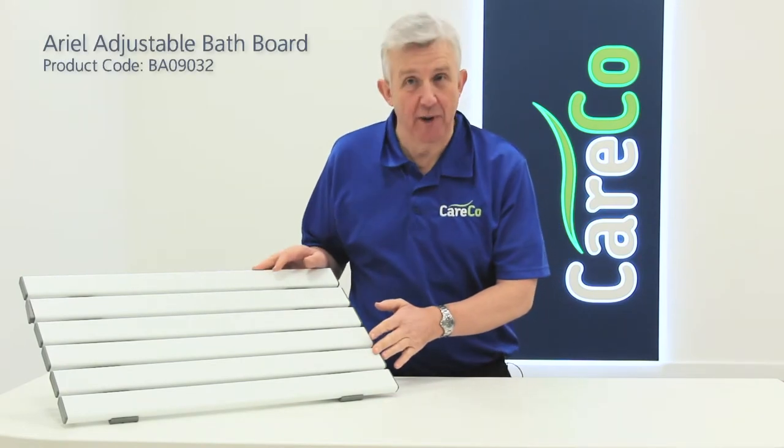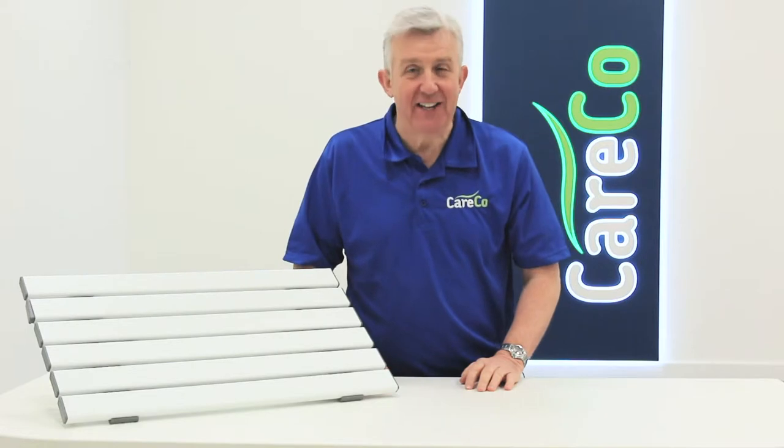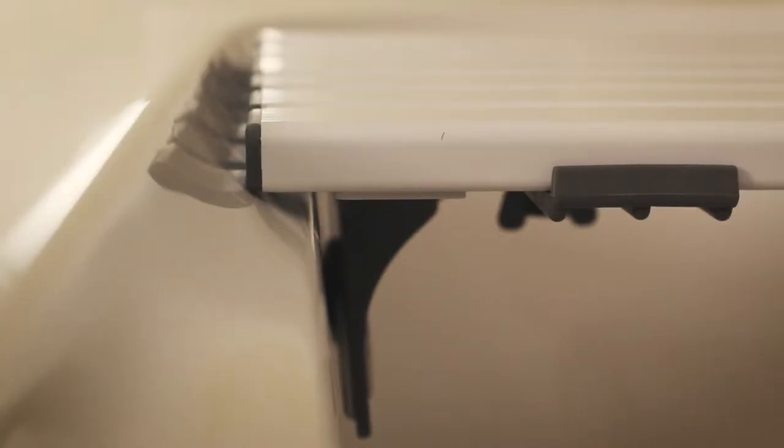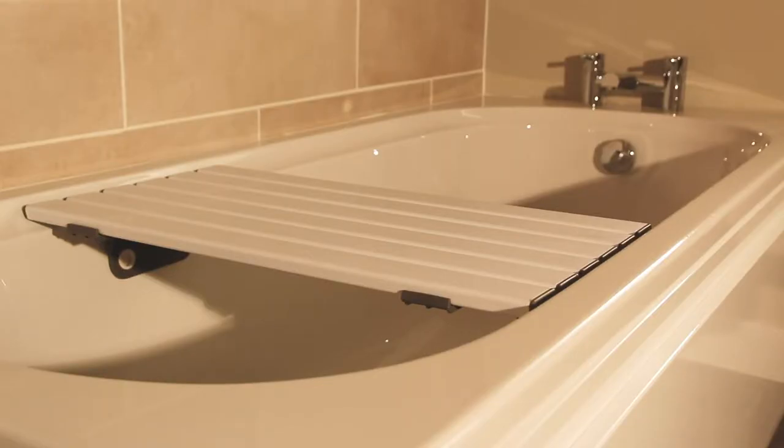This is the Ariel adjustable bath board from Careco, designed to ensure a safer bathing experience. The board is placed across the top of your bath, providing a bench to slide across into the centre of the tub. From this position you can wash yourself without needing to lower down into the bathtub, and you can still access any attached shower fittings.